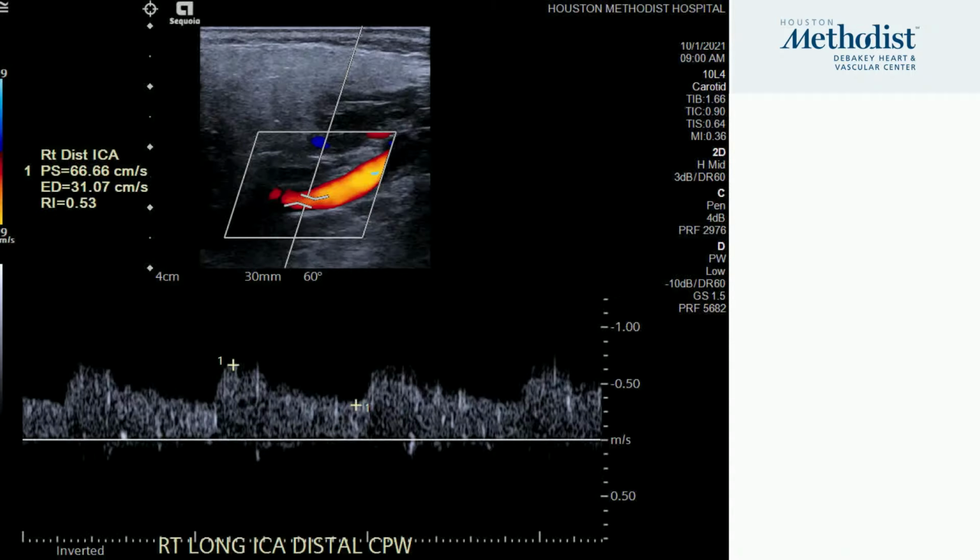Here's a little bit older case, and this is actually the interesting one, when you see lots of microembolus signal, lots of MES in the waveform of the carotid. And I would like to point out the scan is done at 9 o'clock, and the only confirmation is that you see the scan was done at 9 o'clock, and you're suspicious what these microembolus signals are doing on my carotid ultrasound.